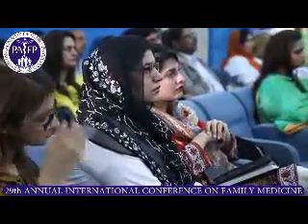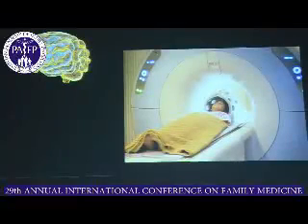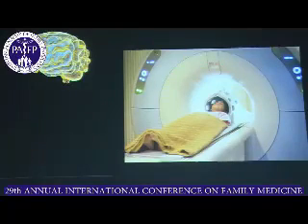All ages can be scanned. There is no reservation. The only absolute contraindications are having metal which cannot go into the MRI, whether because of a pacemaker or because of non-compliant, non-MR-compatible prostheses. But most of the prostheses being utilized in our clinical services nowadays are MR compatible, so that is not an issue.